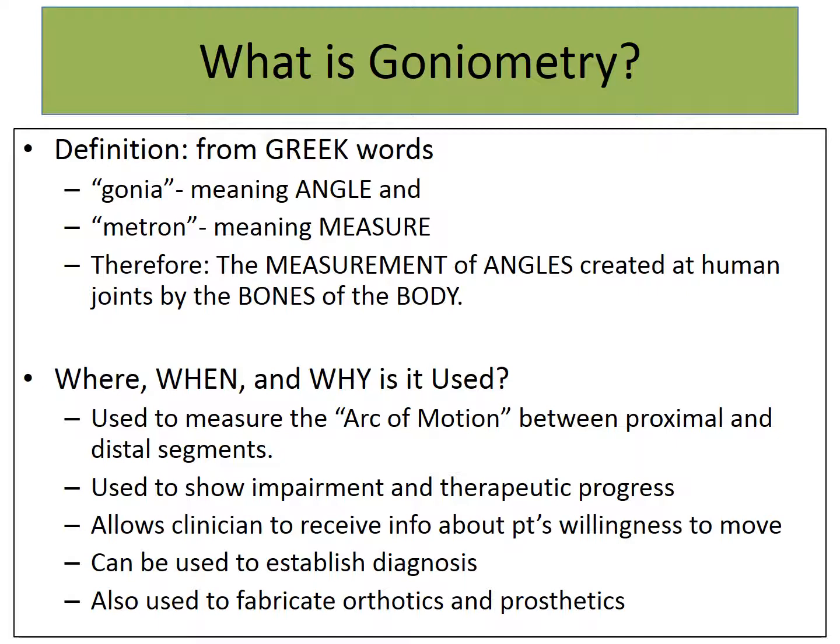It also is a measurement that we can use to show progress. If the PT takes these measurements on initial eval, then as a PTA you can follow up with these measurements and show progress that the patient has been making. It also allows the clinician to get some feedback on that patient's willingness to move. We'll start to talk about end feels and being able to tell maybe if the patient has a lot of pain or if they are anxious for movement, and you'll be able to qualify that in your note as well.